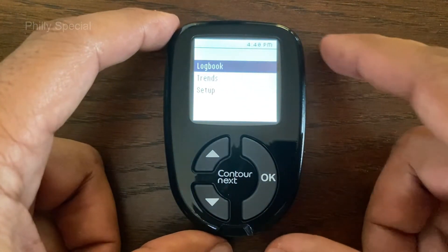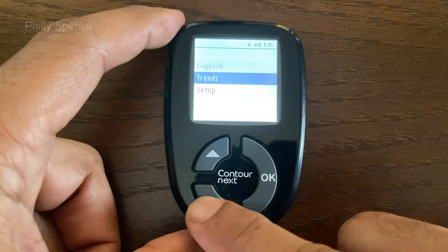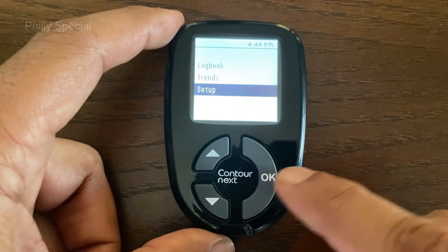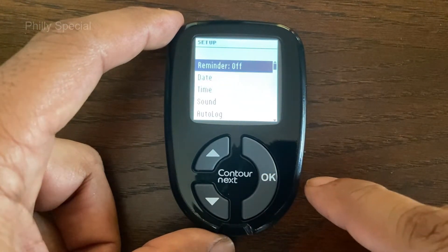The main menu has three choices. Press the arrow button to highlight Setup, then press the OK button.